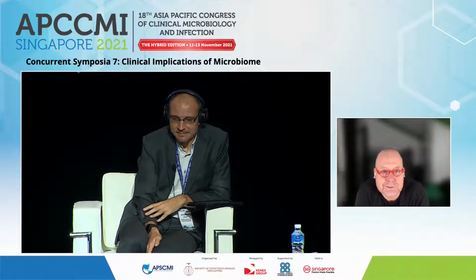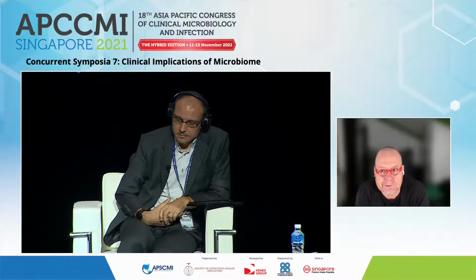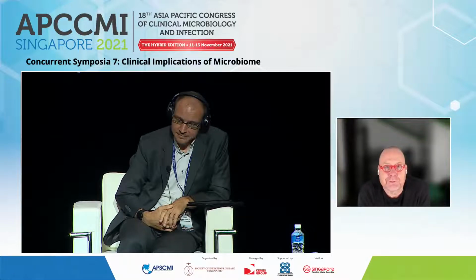Well, that is currently not possible with metagenomics. So we definitely have to work on the turnaround times, and with technologies such as Oxford Nanopore, this may already be occurring. So you can already see the results during sequencing, but still you don't have the results within 10 minutes. So we have to work there.